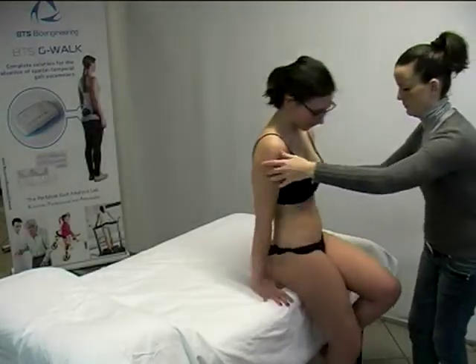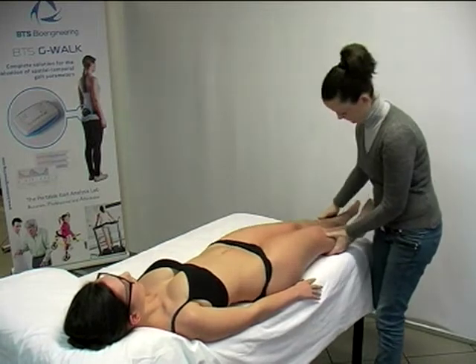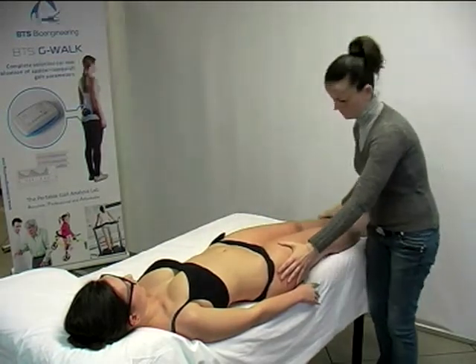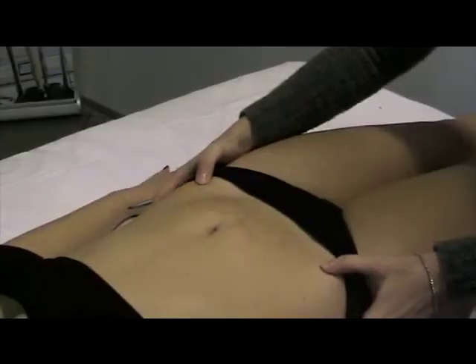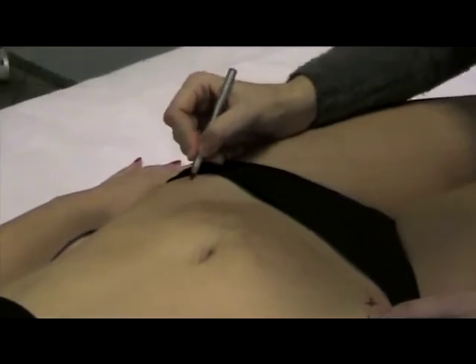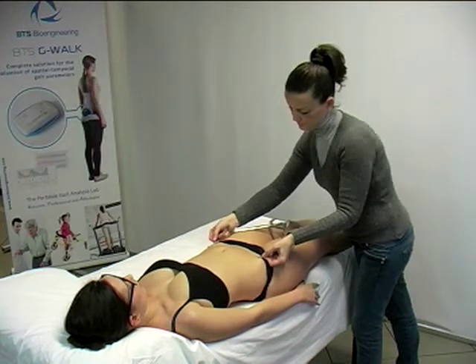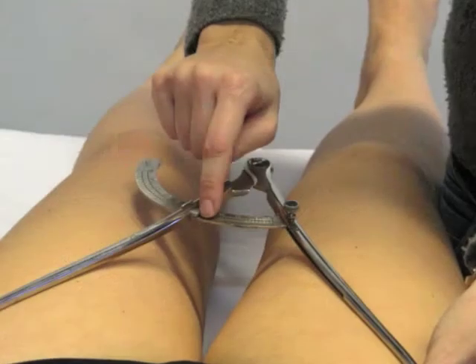The patient is asked to lie down on the bed in the supine position. The subject's weight and height are measured in the standard way. For the other measures, first let's check if the patient is placed correctly on the bed with her pelvis well aligned. To measure the pelvis width, we have to identify the anterior superior iliac spines. You can mark the points with a dermographic pencil. Keeping the pelvimeter in your hands in this mode, lean the two small knobs softly on the two points and read the measure using the superior scale of the pelvimeter, which is expressed in centimeters.